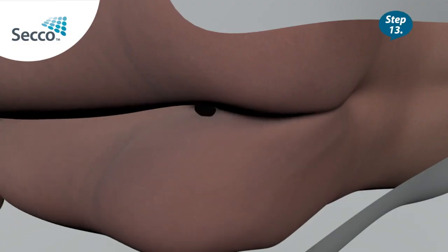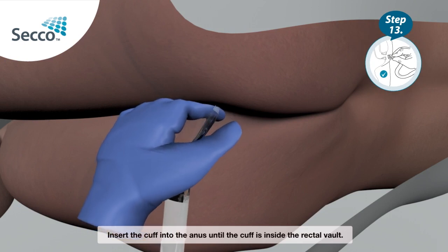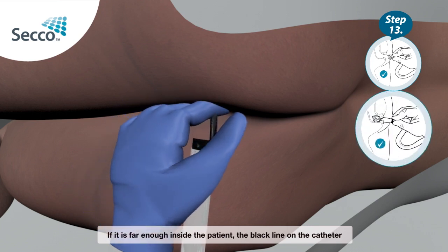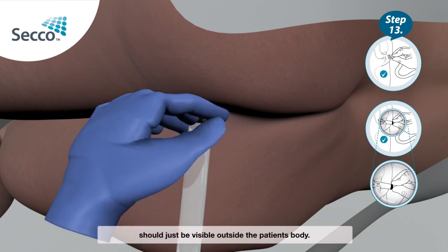Step 13: Insert the cuff into the anus until the cuff is inside the rectal vault. If it is far enough inside the patient, the black line on the catheter should just be visible outside the patient's body.